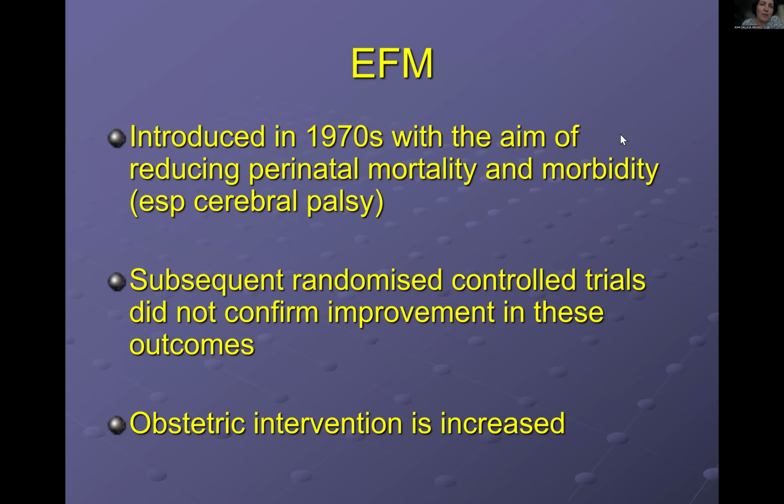Now, what about electronic fetal monitoring? Electronic fetal monitoring was introduced quite some time ago now, almost 50 years ago, in the 1970s. The idea was to make delivery safer.